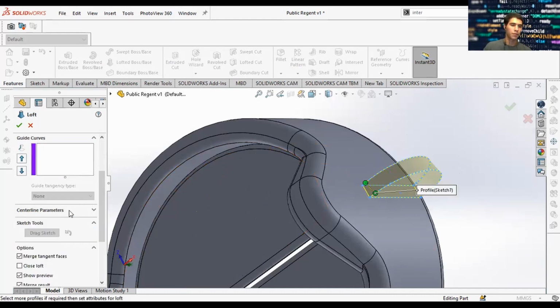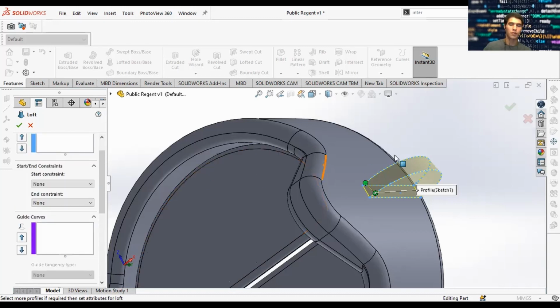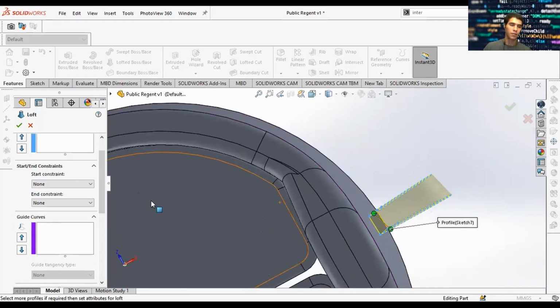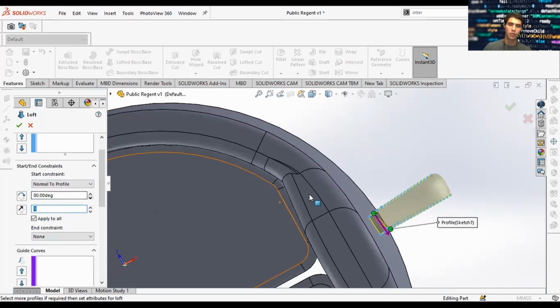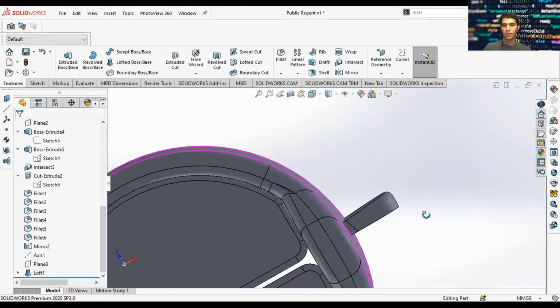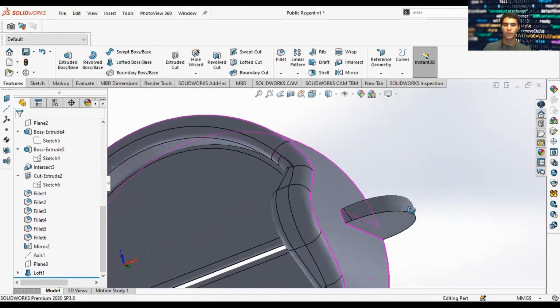Some parameters that you can use when doing lofts. You can have start and end constraints. And since our shape is small, we wanted to have rounded ends. This would be a nice way to make that start and end constraint. We would add a normal to profile vector. And it will round it. So for example, with 0 normal to profile degree, it would be a straight shape or a straight line. As you add more degrees, you're getting more normal at the initial offset of this entire loft. So that'll be the initiating constraint on this side, and the end constraint would be straight. Let's go ahead and add it. And there we have a loft.